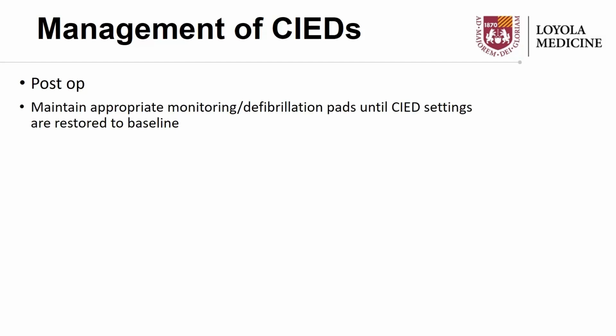Postoperatively, after the operation, it's important to still closely monitor the patient with EKG, blood pressure monitoring, and defibrillation pads until reactivation has occurred. Reprogramming in the OR prior to transport is preferred, but if needed, and we've experienced this, if we're unable to get a hold of the pacer clinic, reprogramming in PACU can occur.